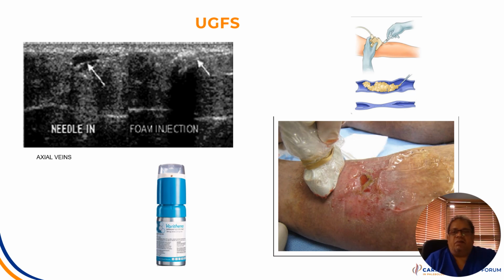Ultrasound-guided foam sclerotherapy is relatively easy to use and can be used to inject almost any varicose vein, including around the wound itself, using the technique called terminal interruption of refluxing source or TIRS. There are, however, some questions about the long-term efficacy of this treatment.